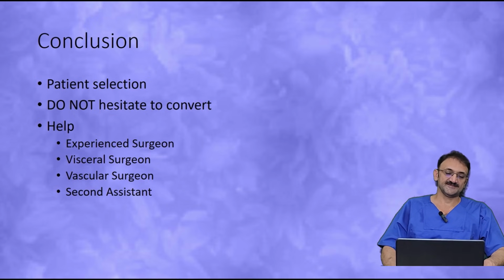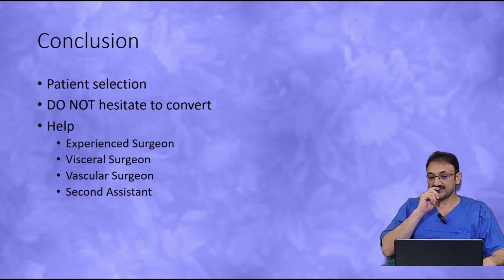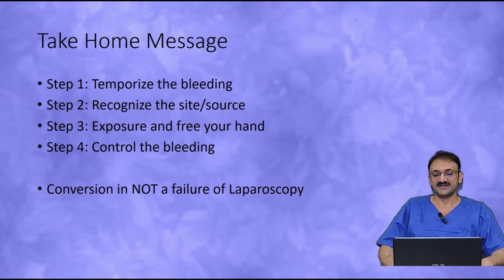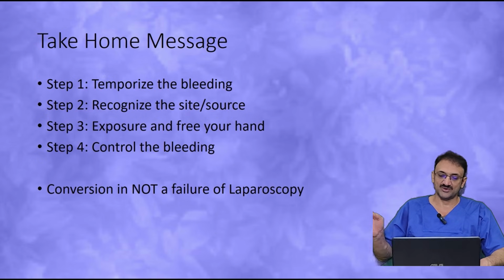So these are the conclusions of the presentation. And really, I would say that prevention is always better than cure. If you really prevent by doing a proper selection of the patient, you'll be in a really good position. So the take-home message is, step number one: if it bleeds, always temporize the bleed. Once you temporize the bleed, or temporarily control the bleed, only then can you decide whether you want to deal with it with minimal access or you want to convert it.